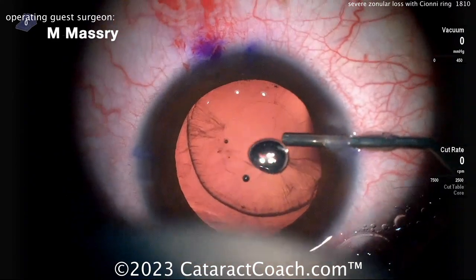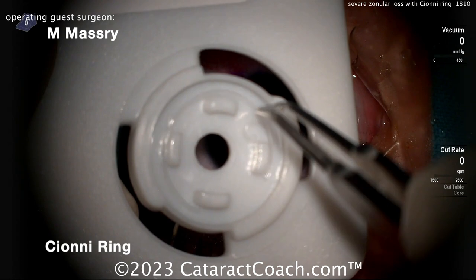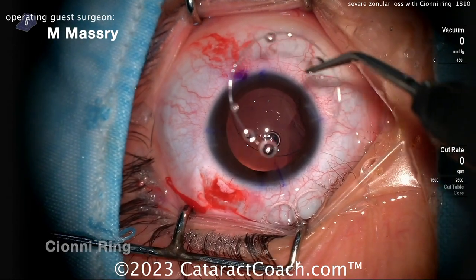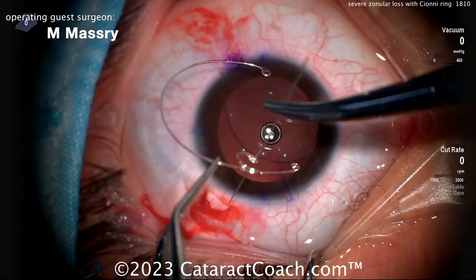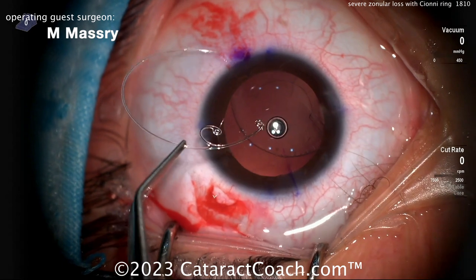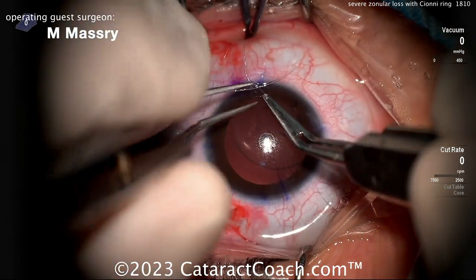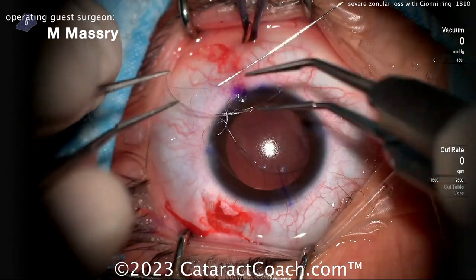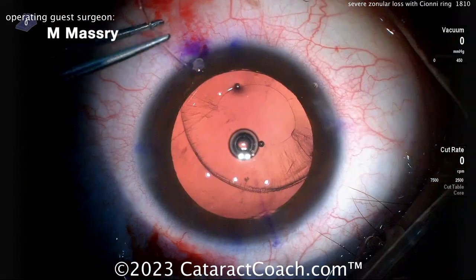Because the capsular bag will just come up and you'll get a lot of vitreous prolapse too. Use plenty of viscoelastic — now filling up the capsular bag. There's the round rhexis. Here's the Cionni ring — that's a CTR, a capsular tension ring with an extra eyelet on it to allow for suture fixation. That eyelet goes above the capsular rim, so threading it first with a 10-0 prolene. That's going to help maintain positioning and provide support. Nicely done.